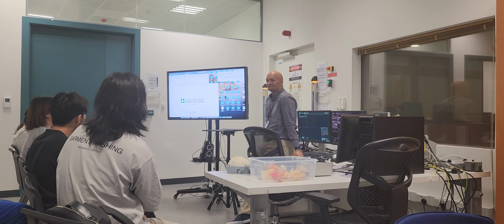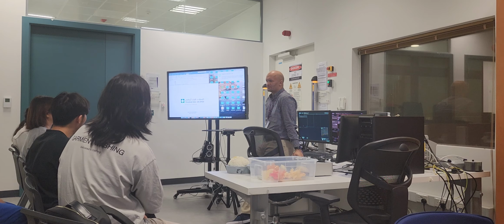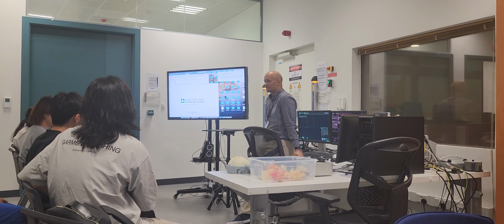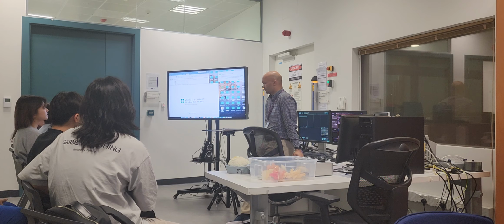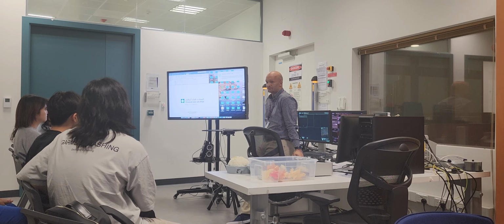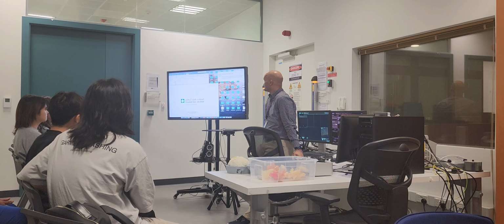Thank you. You're welcome. I haven't even talked about spectroscopy that we do here. We do some in vivo spectroscopy, but we don't do it on a routine basis, to look at metabolites in the brain. And some tumors have elevated choline. It's a marker for malignancy in tumors, so they do it routinely.